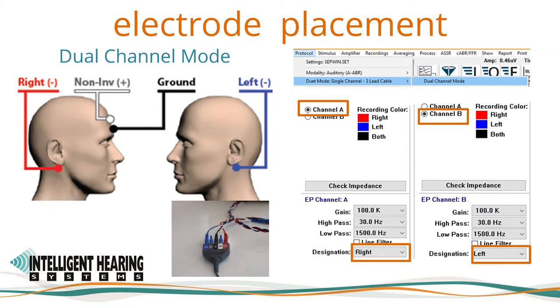In the amplifier settings window of the software, Channel A — which is the red input on the cable — will have a channel designation as right, and Channel B — which is the blue input — will have a channel designation as left.